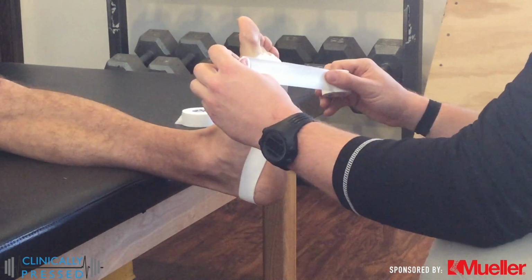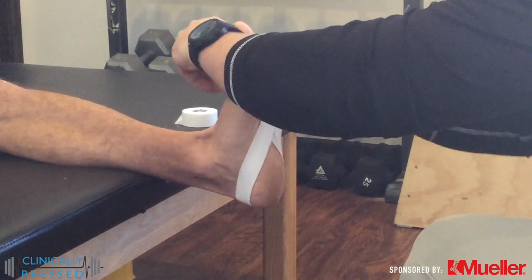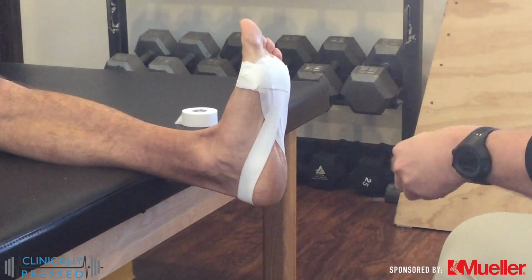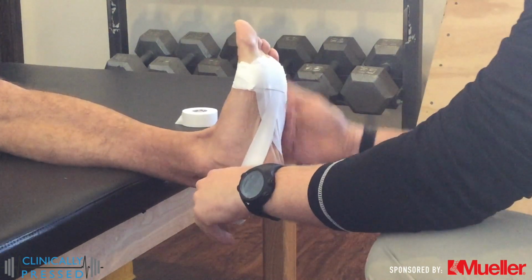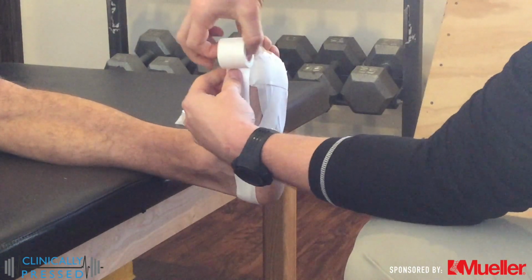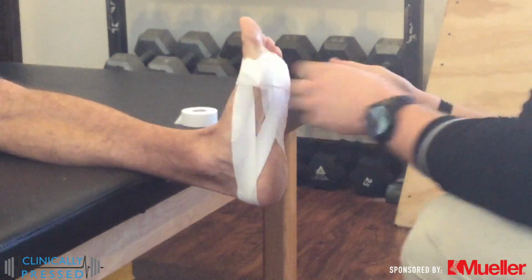We can then take another anchor strip to make sure that we lock down all those ends so they're not falling off once our patient steps down on top of those strips. Then, to add a second part to this tape job, which you could also do on your own, we're going to do another anchor strip that's going to go all the way around. You can do this from medial to lateral.